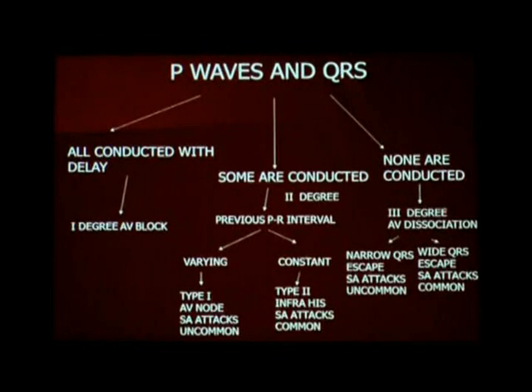The commonest physiological arrhythmia in children is sinus arrhythmia, where the heart rate quickens in inspiration and slows down in expiration. The one clinical condition which abolishes sinus arrhythmia in children is a large atrial septal defect. Right coronary artery disease can produce sinus arrhythmia in adults. When it does, it is most often not related to respiration, which is called non-phasic sinus arrhythmia. Absence of sinus arrhythmia in children is abnormal. Presence of sinus arrhythmia in adults is abnormal.